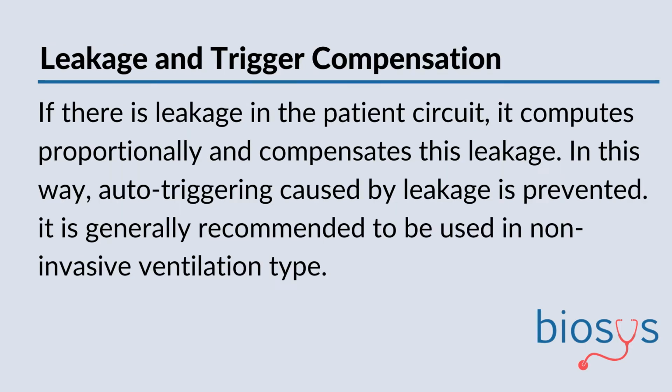Leakage and trigger compensation. If there is a leakage in the patient circuit, it computes proportionally and compensates this leakage. In this way, auto-triggering caused by leakage is prevented. It is generally recommended to be used in non-invasive ventilation cases.